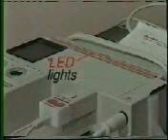When the ZOLL is plugged into a standard 120-volt AC outlet, the system will automatically run independent of the battery system. The power for the ZOLL system is maintained through the power charger unit, which is attached to the back of the ZOLL PD 2000. The function of this power charger and the condition of the battery are displayed on the ZOLL 2000 with LED status lights. An on indicator means that the unit is plugged into regular AC power. A battery-ready or charger-on indicator shows the status of the battery in the device. A fault indicator shows that there is a problem.